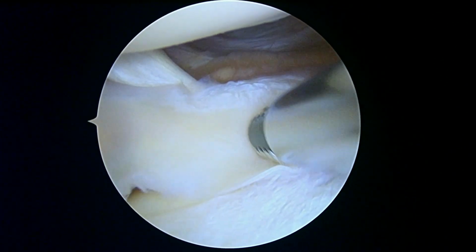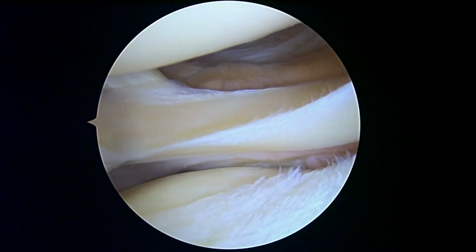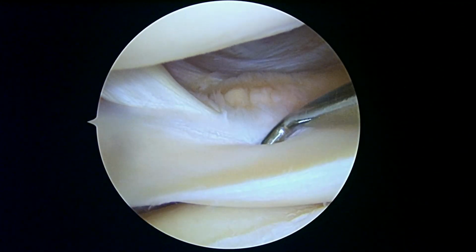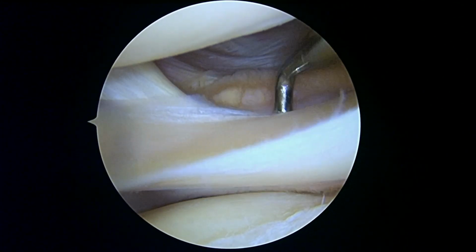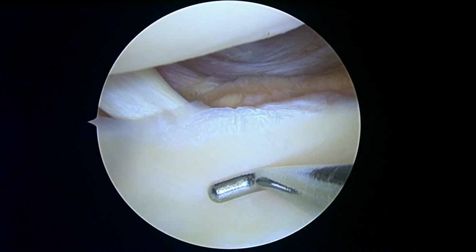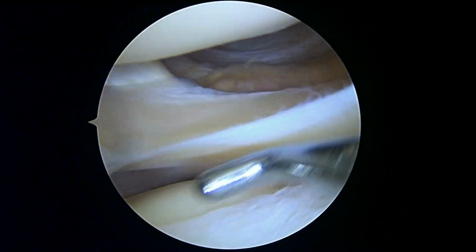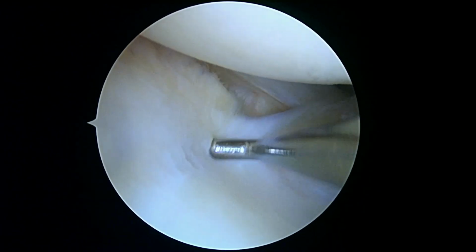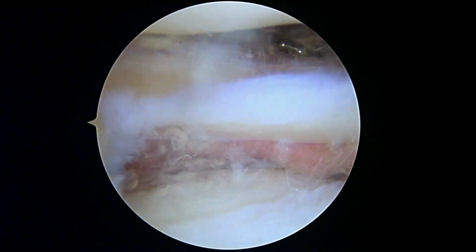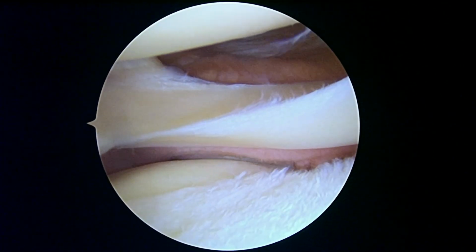Back here, the meniscus looks like, let me take a probe. It looks like it's okay. We're just going to probe it just to make sure. So we can see a little split maybe there, although my probe really won't go down into it. So that's a superficial split right there. And again, I don't think we need to repair that. And then here we can see the rest of the meniscus is well attached. Let me just turn on a little bit of suction, and now we'll go ahead and take a little bit of a pair of scissors basically and trim up the edge, and we'll be done here.